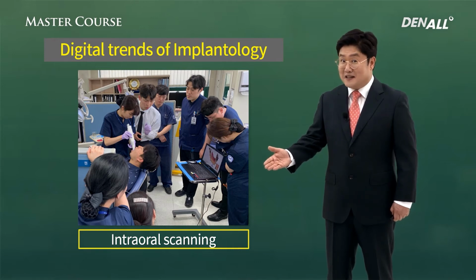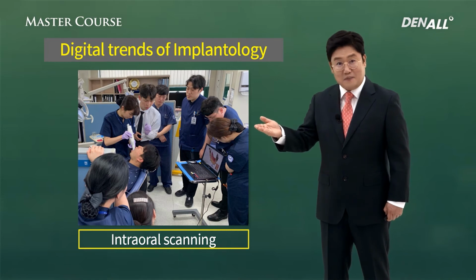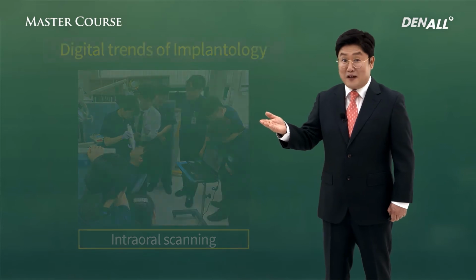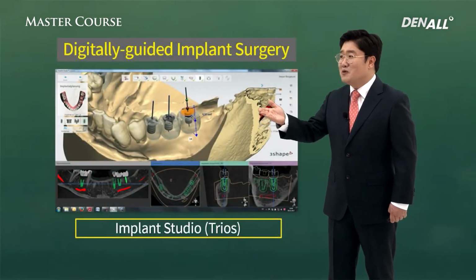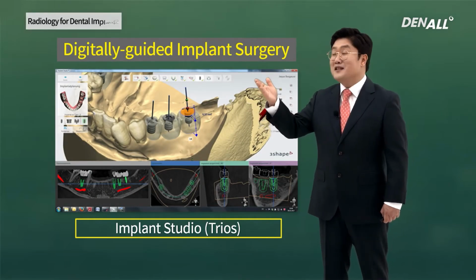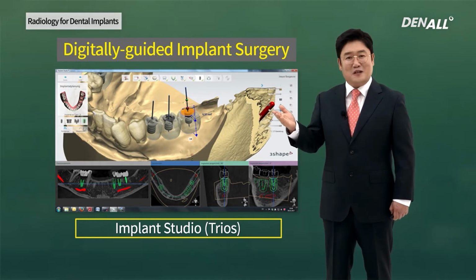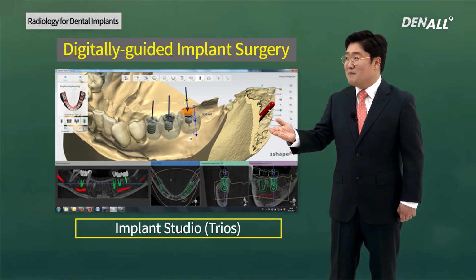Intraoral scanning is done to acquire information of the oral situation. The information can be put together, and three-dimensional, more accurate information can be used for digitally guided implant surgery. There are programs to plan for such surgery.